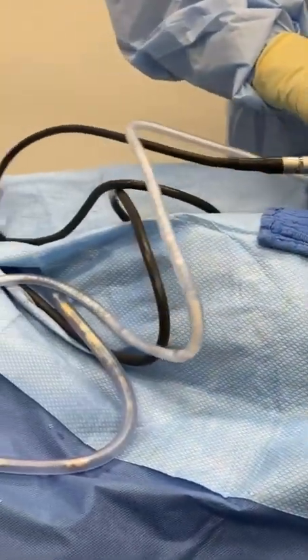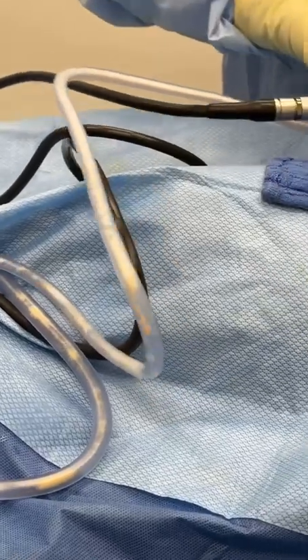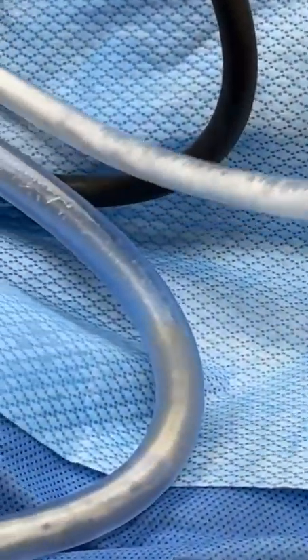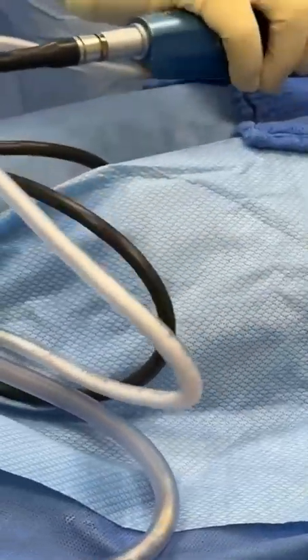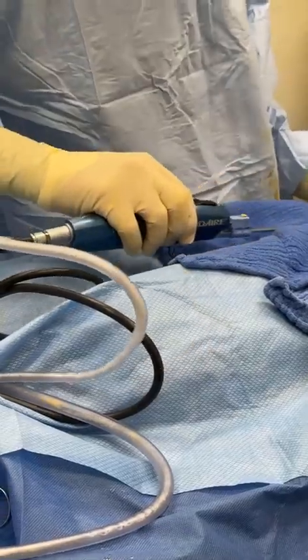Did you see it bleeding? What color is that? That's incredible. Even on a male, we can do these white aspirates, but it has to do with the way we do these, how controlled my movements are, very, very slow. I think the speed is number one, and also the fact that we waited over an hour before we start. That's also key.